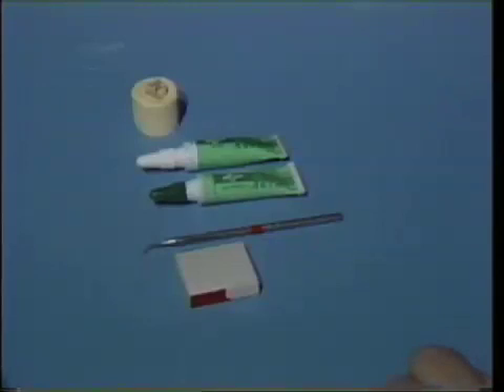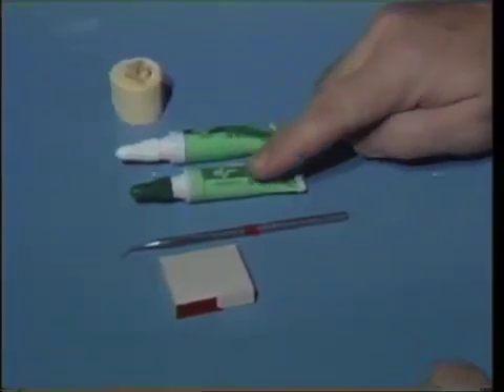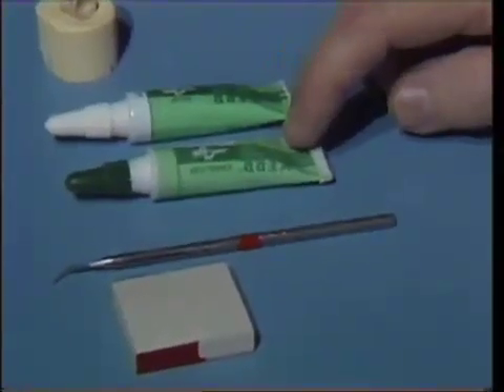What we'd like to show you is the mixing of a low strength calcium hydroxide base material for application against fresh cut tooth structure for pulpal protection. There are many low strength calcium hydroxide pastes available. The one that we're going to mix today is the Life material manufactured by the Kerr Company here in Romulus.